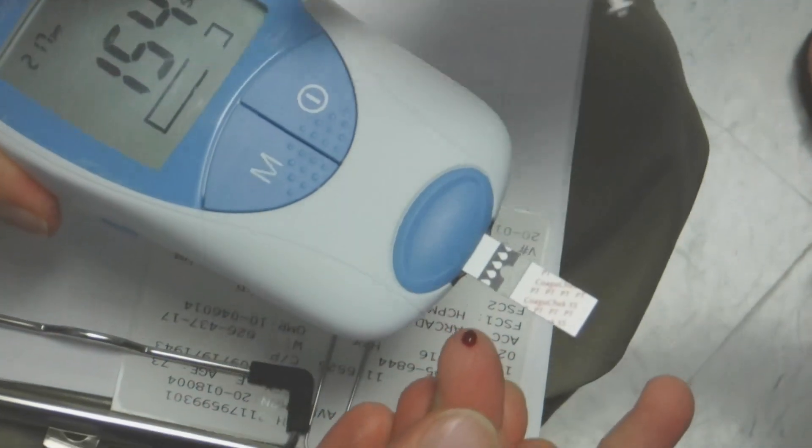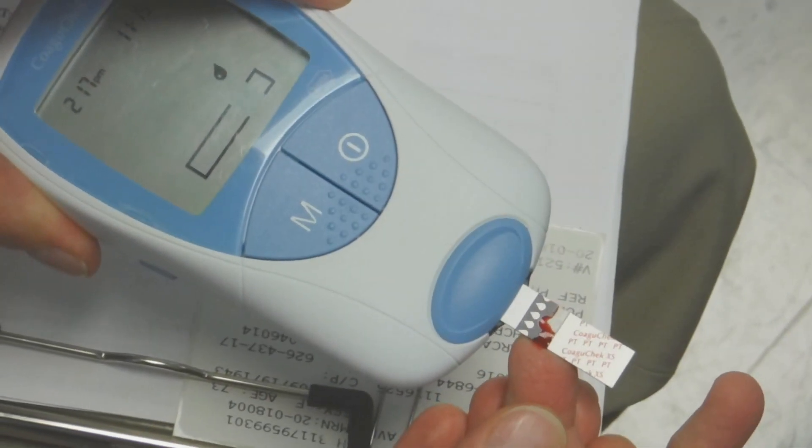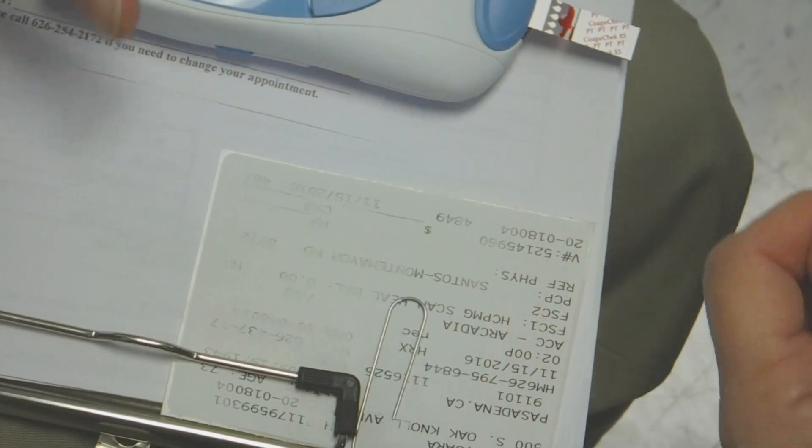Is it all done? Oh, it's counted. You slide it right there. Oh my gosh, look at that. I'm going to need these instructions for sure. I don't usually bleed much afterwards, as you can tell.